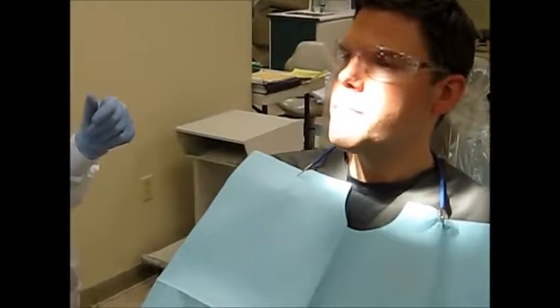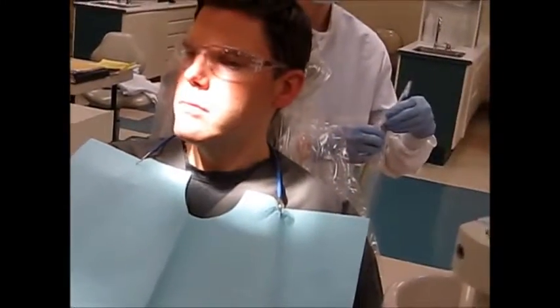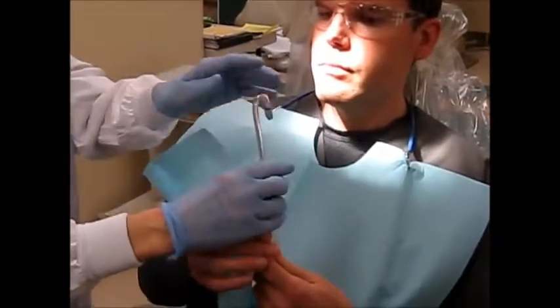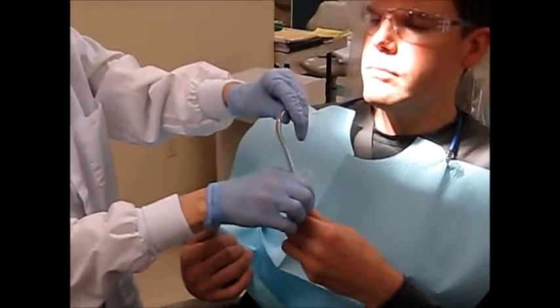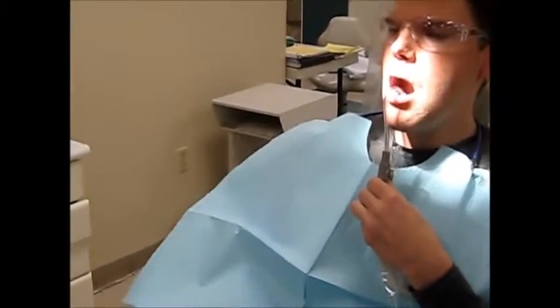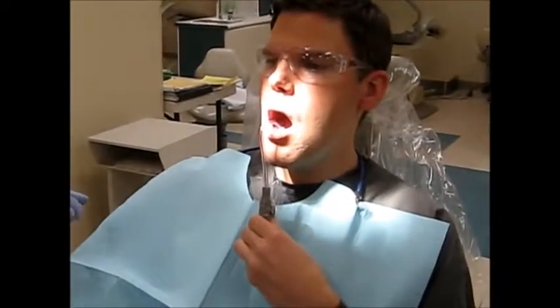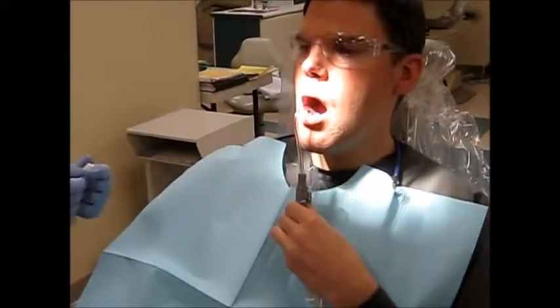I'm going to ask the patient at this point in time to remain wide open. I'm going to obtain the saliva ejector and turn it on. I'm going to give it to the patient and ask the patient to hold the saliva ejector intraorally and not close down around that saliva ejector at all to create a vacuum seal. At that point in time, I'm going to take 4 cotton rolls. I'm going to ask the patient to remain wide open, breathe through his nose, and not to swallow anything.